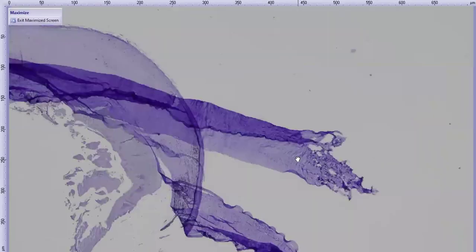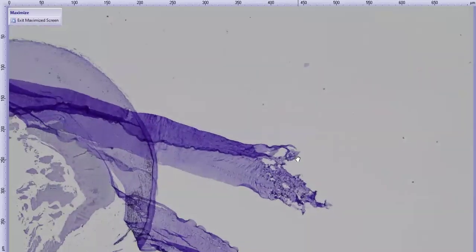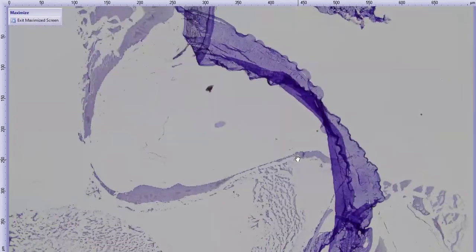So we did some IHC on this case. And I will show you this one first. Kind of spaced out during the history. Did they say anything? They thought it was anterior uveitis, which it was. There was also anterior uveitis. It's another one of these cases, which is frustrating.